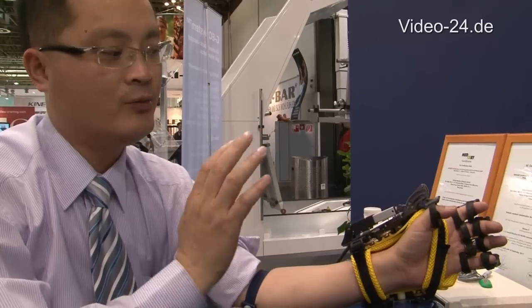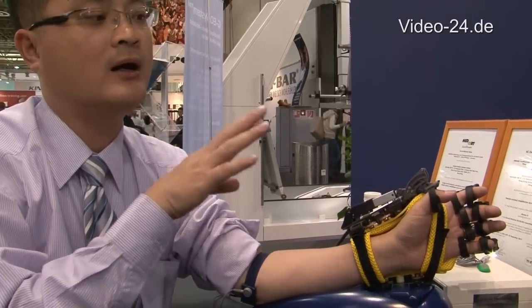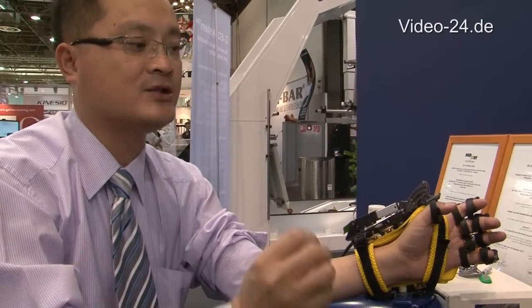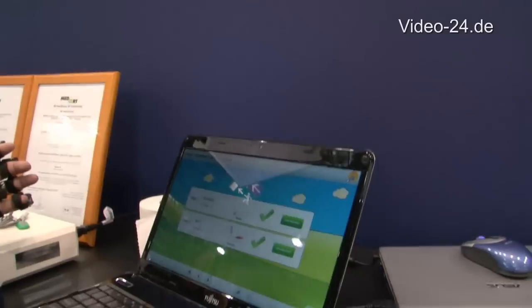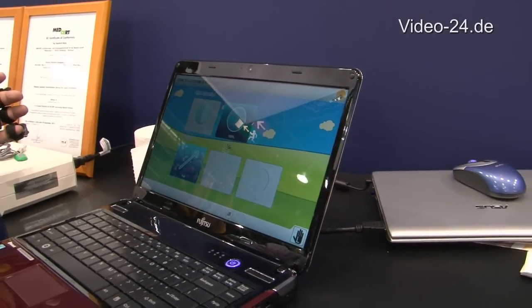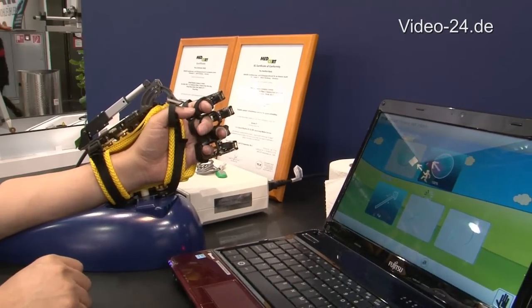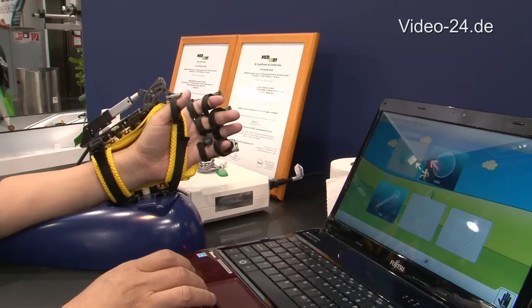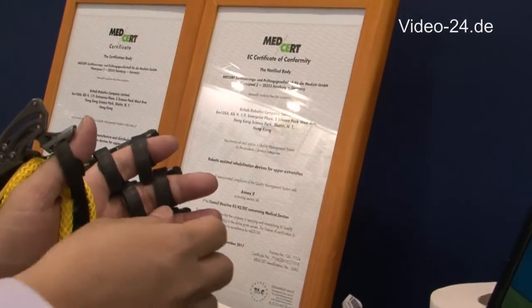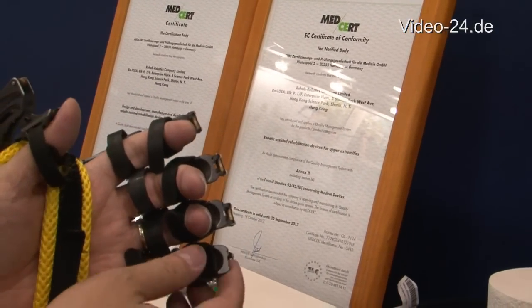So now I have the resting EMG signal from the muscle, and also the intention extension EMG from the muscle. Now I let the patient feel the robot first, so that everything is okay. Yes, then I go forward.